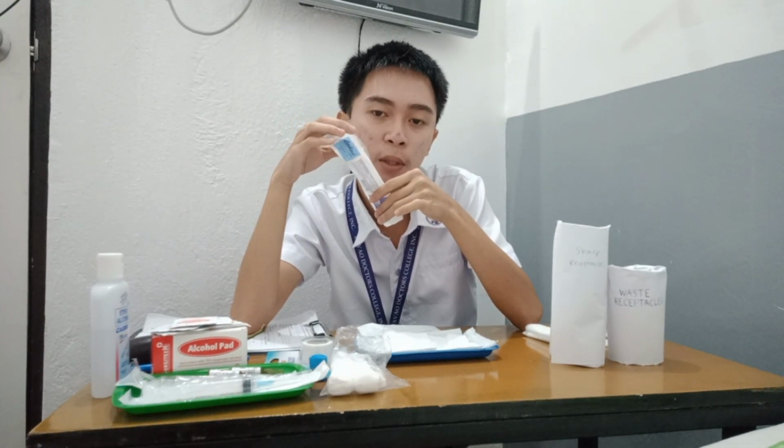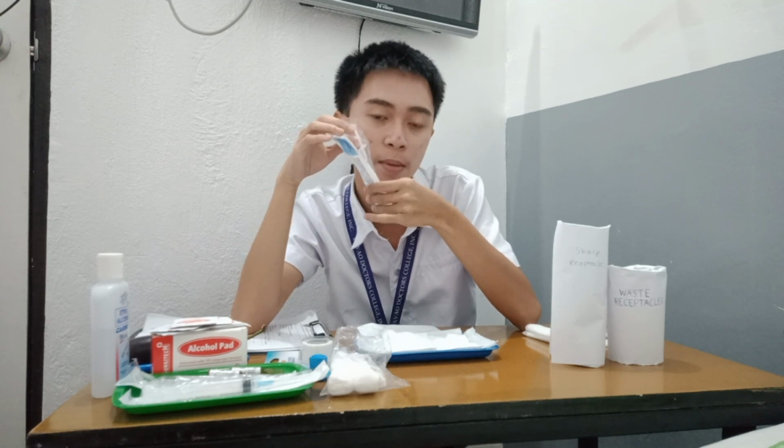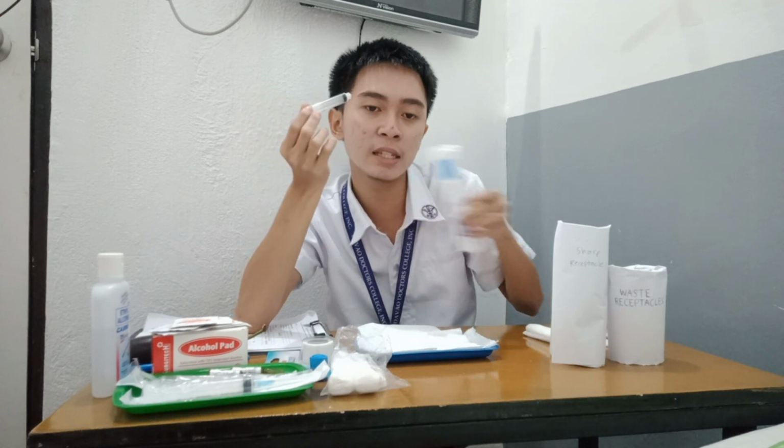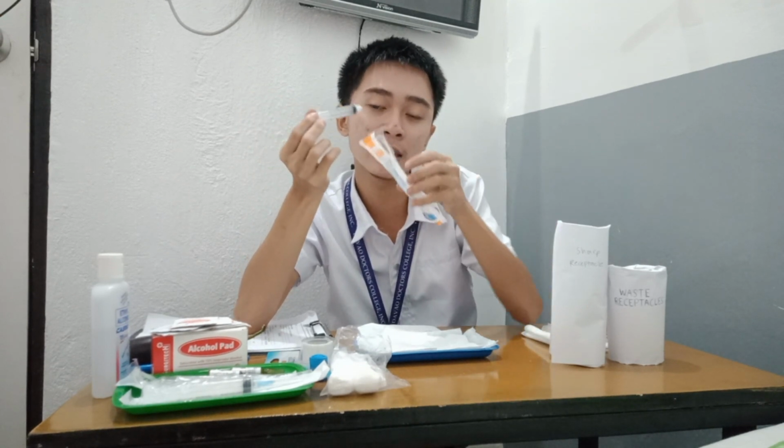An aspirating needle will help reduce the risk of having glass in the medication. So I'm going to connect my syringe to the needle and make sure that the connection isn't loose, then I'm going to set it down first.